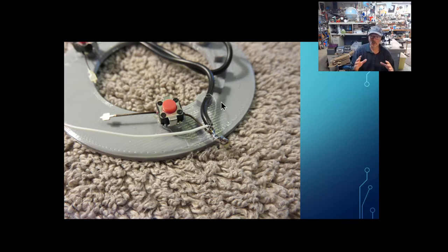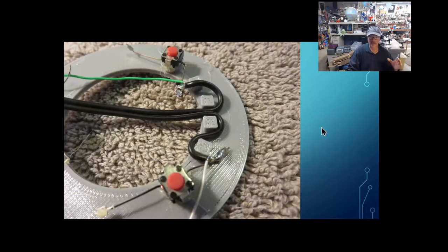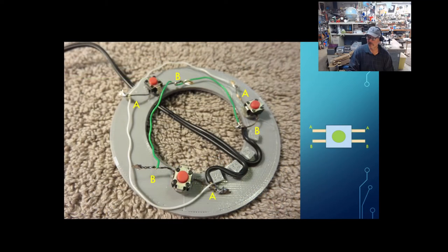You do want to keep wires to the minimum. You don't want a lot of excess wires running all over because you will have the cap fitting on top of that. And when you hook these wires up, hook them up where these four little posts are, because we're going to use that later on as a strain release. We're going to put a little bit of hot glue on that just to hold it in place. So you can strip them, put them right there. Continue now with the rest of the wires.